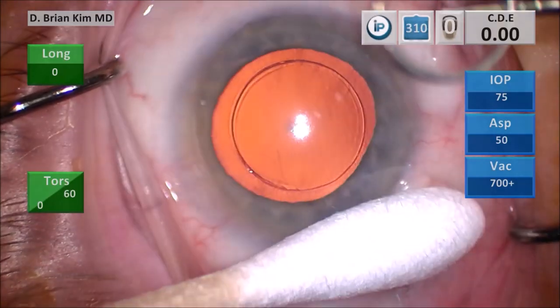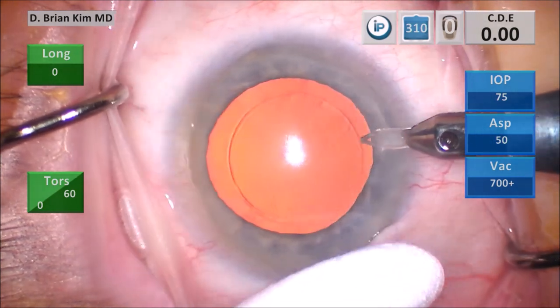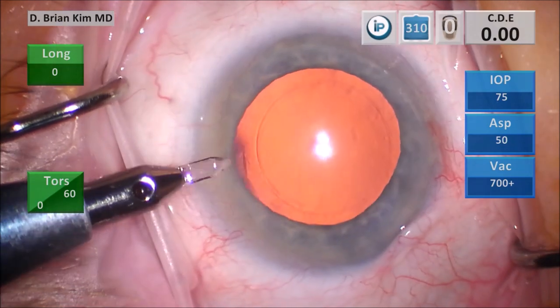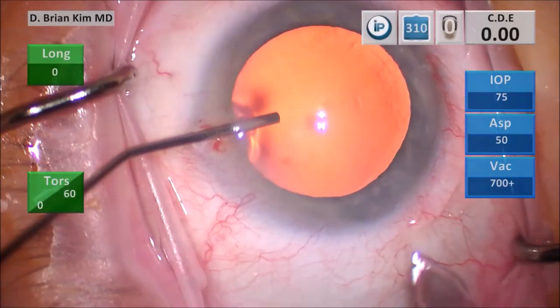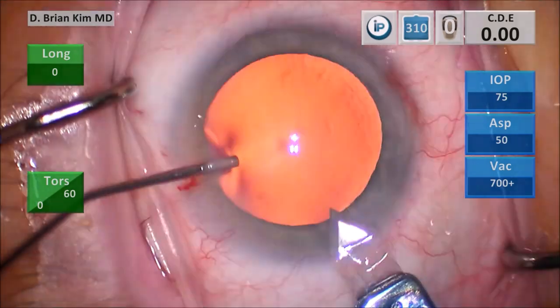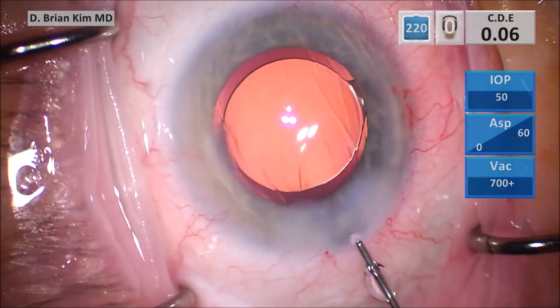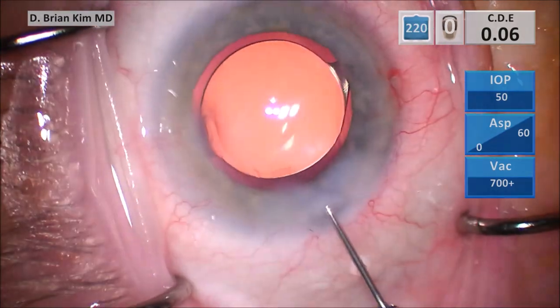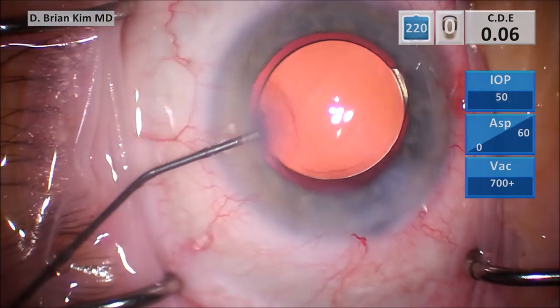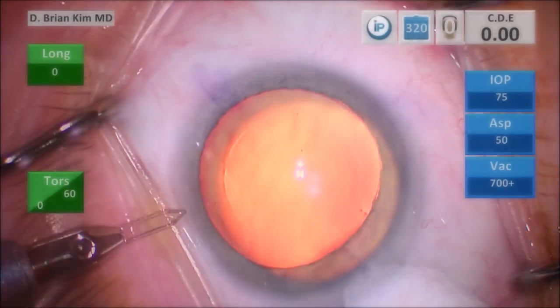The main principles are: use a cotton tip to help rotate the eye so that you can make the most precise angle when making your paracentesis — be as flat as possible to the iris plane to get a nice rectangular incision. Sometimes surgeons are not intentional, make a very short incision, and are destined to have a leaky wound. You want to make it as long as possible — the longer the better. As long as the length of the incision is longer than the width of your blade, you should be good to go. The longer it is, the more likely it will seal. Similarly, when you make your main incision, make that nice vertical groove that provides enough structural strength to the outermost portion of the wound.